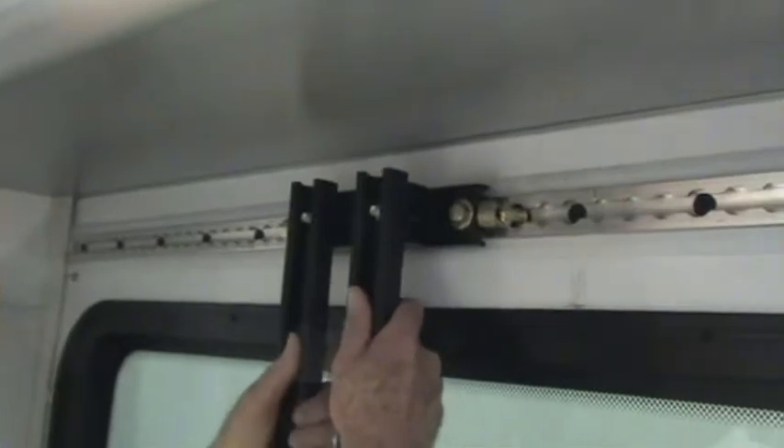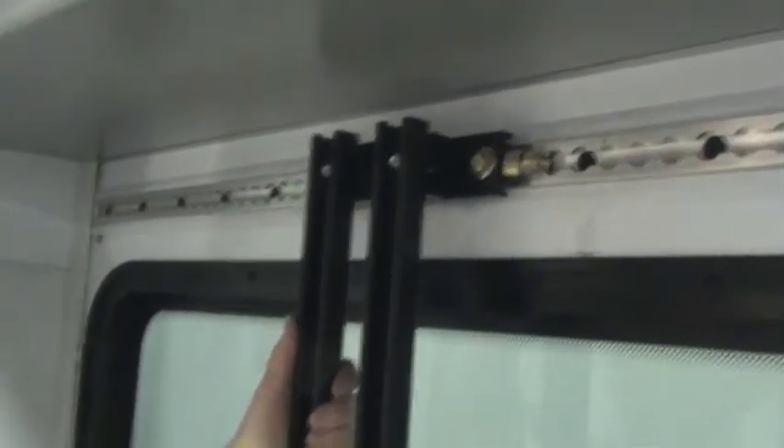Find the right two holes here. Make sure the bracket is clear and we're locked in. A little pressure to the right to get that to lock in.